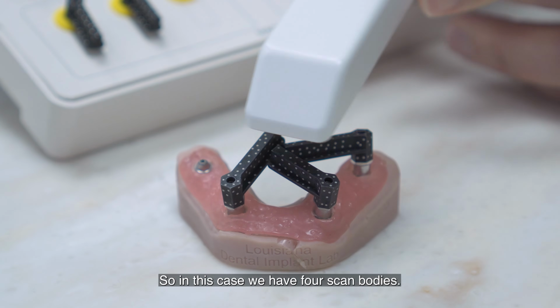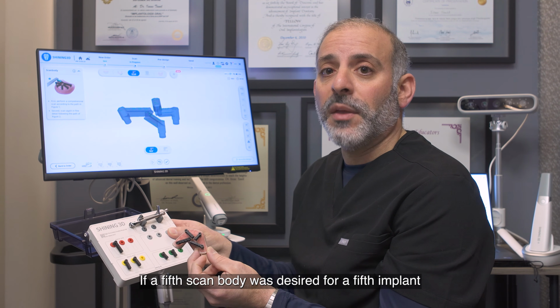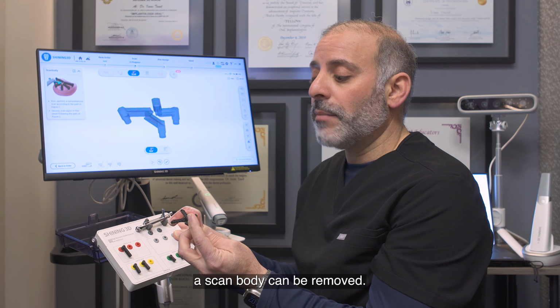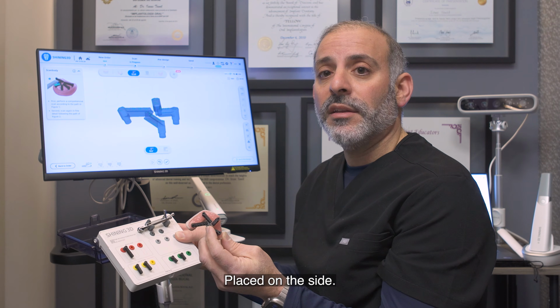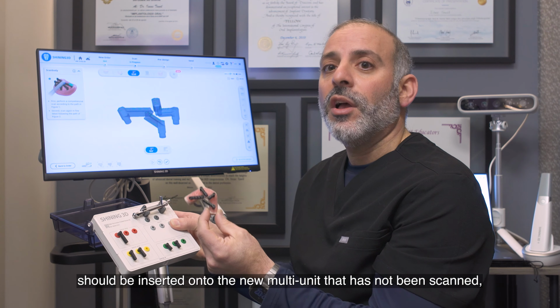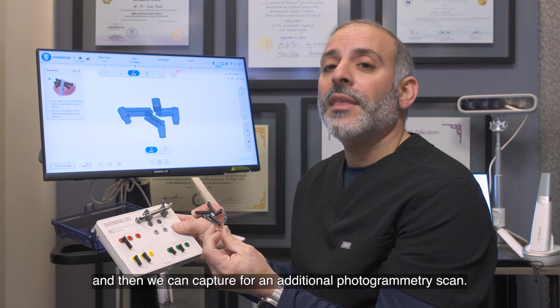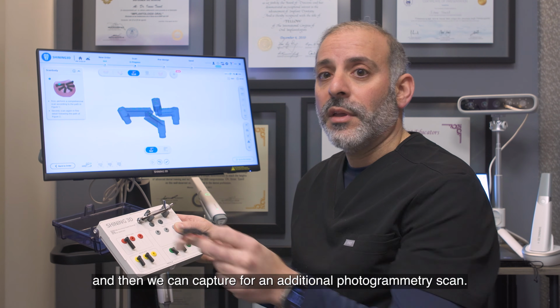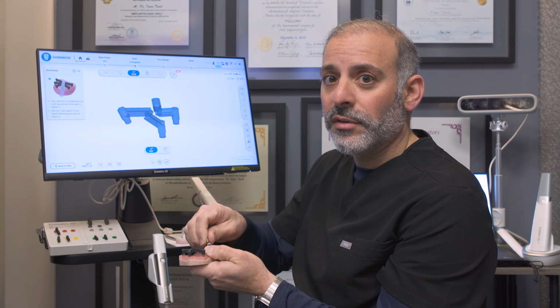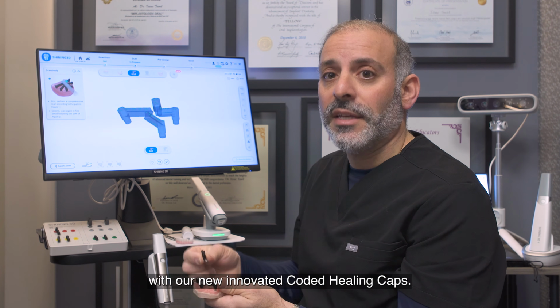So in this case, we have 4 scan bodies. If a 5th scan body was desired for a 5th implant but was unable to be captured in this window, a scan body can be removed, placed on the side, and a new scan body that has not yet been scanned should be inserted onto the new multi-unit that has not been scanned, and then we can capture an additional photogrammetric scan. The photogrammetric scan bodies are then removed and now replaced with our new innovative coded healing caps.